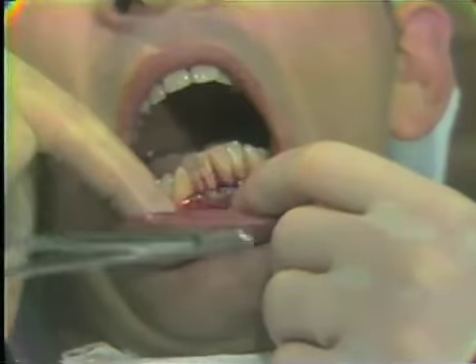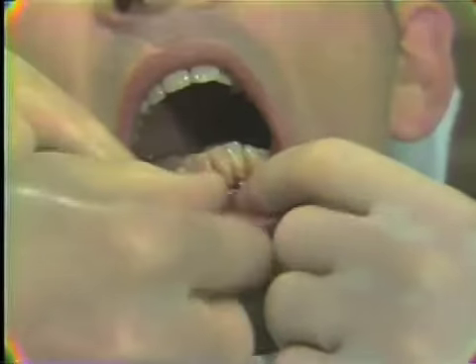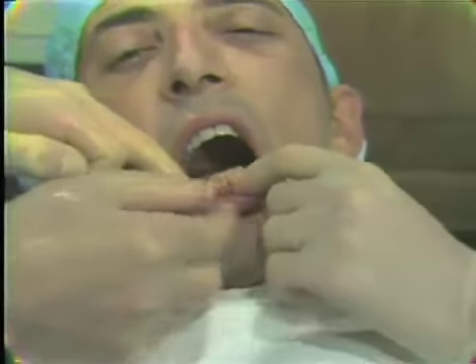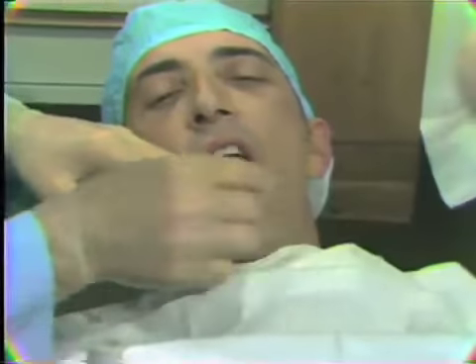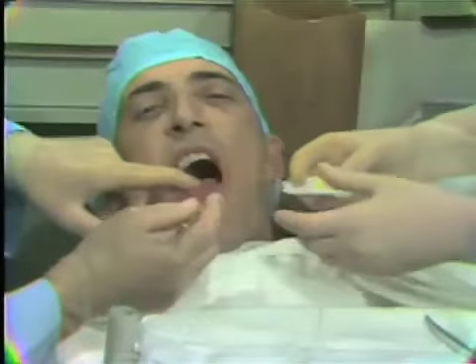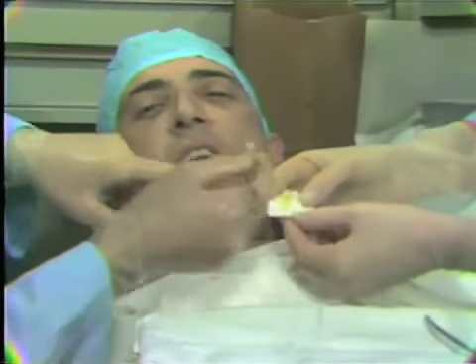Now, having completed the placement of the sutures, we'll move to placement of the Achromycin ointment. This is standing by on the countertop, and we will use a plastic instrument to place the Achromycin ointment.